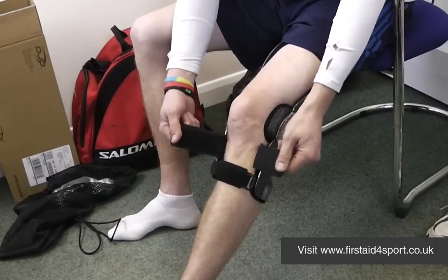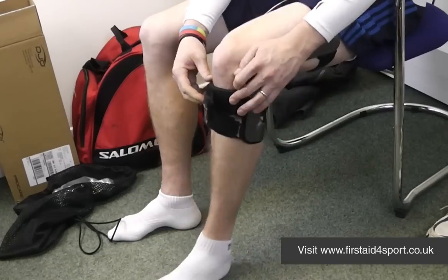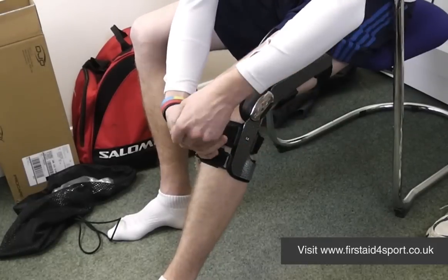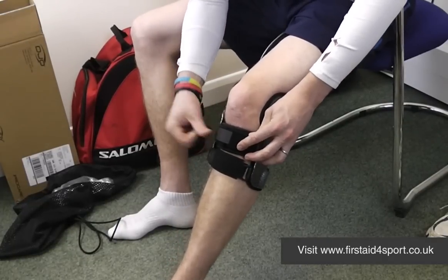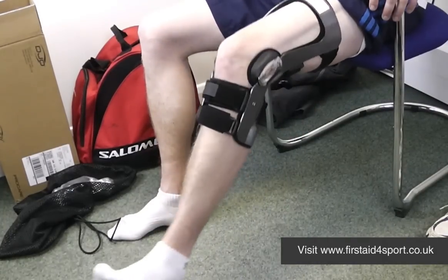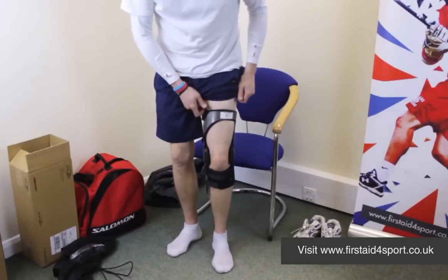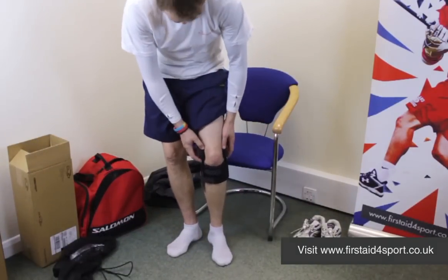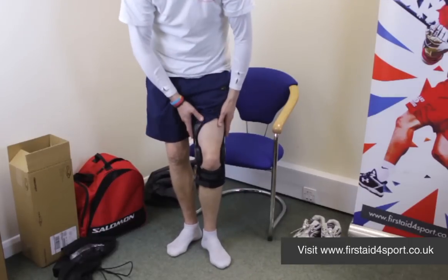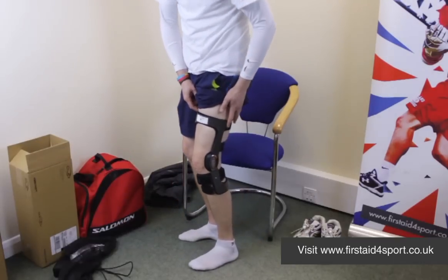Number four: there's an internal cuff, so you pull the cuff over and Velcro it down. Then on top of the cuff, there's another Velcro strap that goes through and just pulls tight — and that's number four. So there are your four points and the Armour is then in place. What you want to do is walk around with it, feel how it fits on your knee, and when you take it off, if you've got red spots or real sore points, just adjust it and see how it feels. But that's the DonJoy Armour with force point hinge.